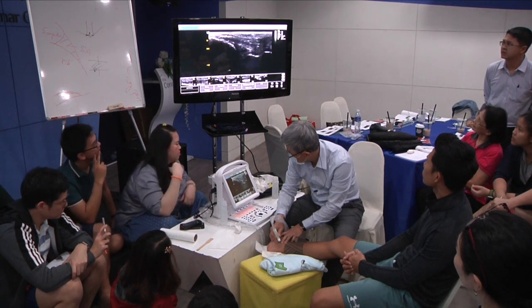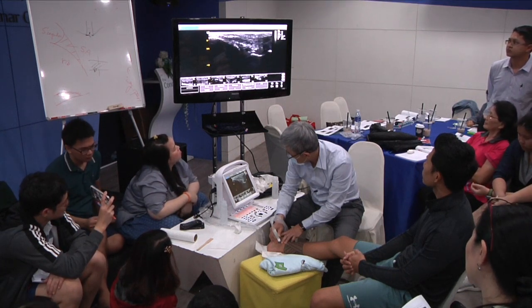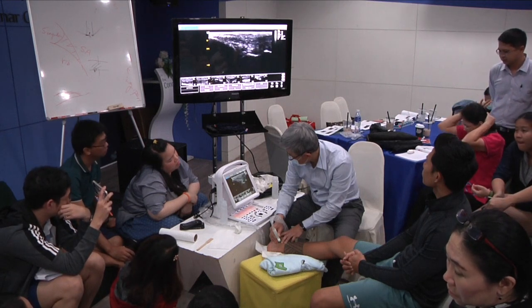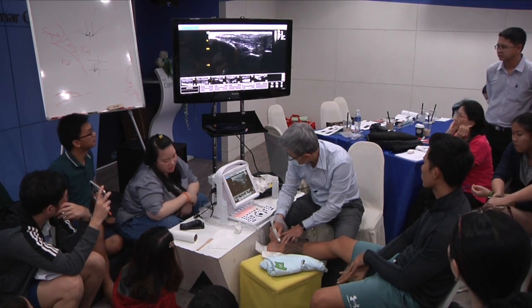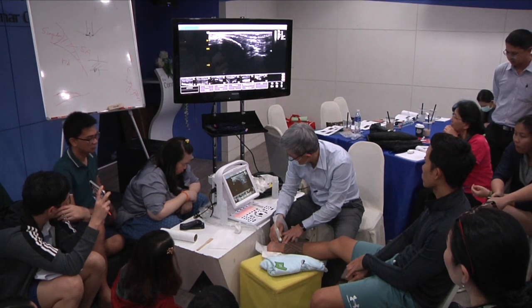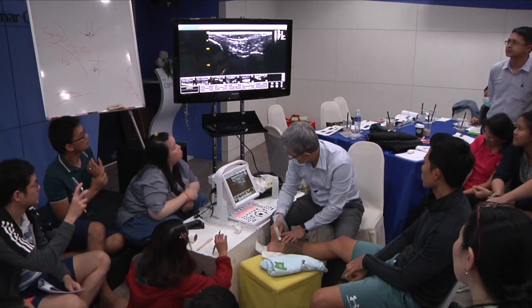Good. Then the distal side. Cool. Freeze.